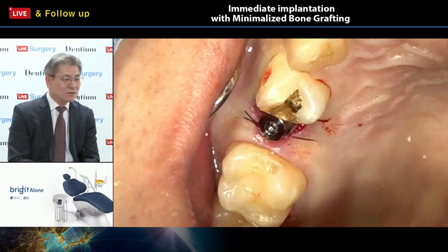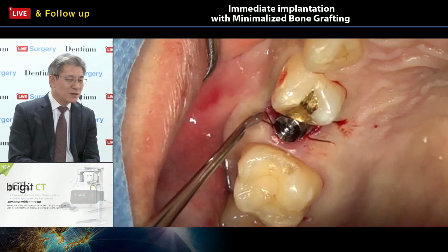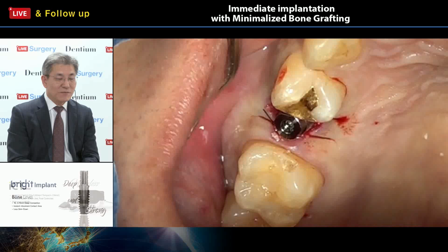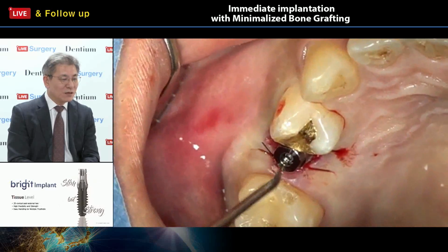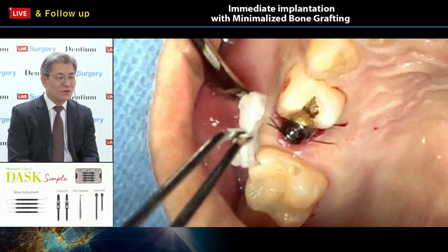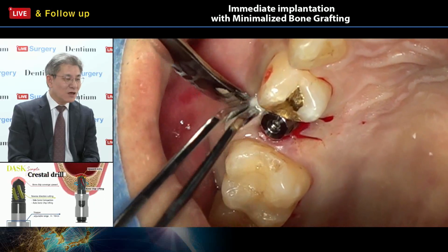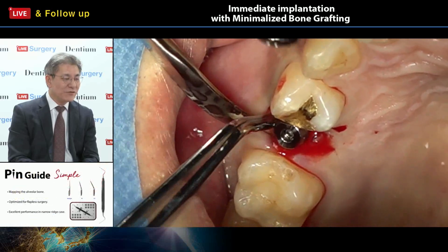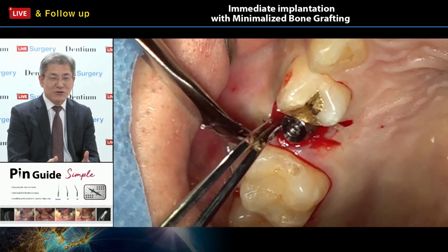So I think the proper connection is the digital abutment with the implant fixture, tissue level already. This particulated bone for the purpose of gap filling is good. And now this collagen matrix is applied on the buccal area, protecting this particulated bone.